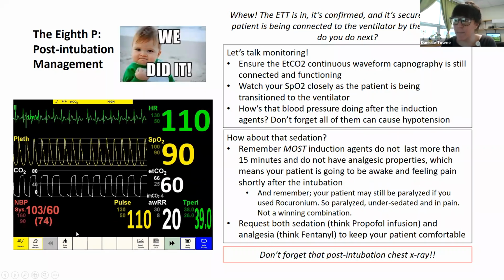And then we want to make sure we're checking that blood pressure. How did it do after all those induction medications? You know, we gave a bolus of a medication that can cause hypotension, and now we're getting ready to start our sedation. So where are we looking on our hemodynamics?